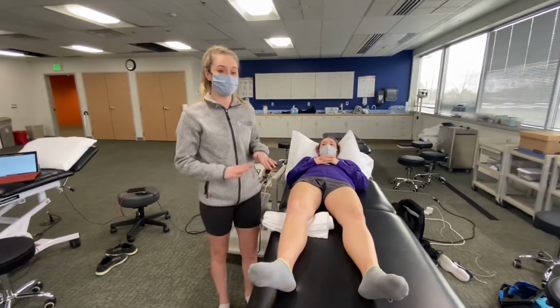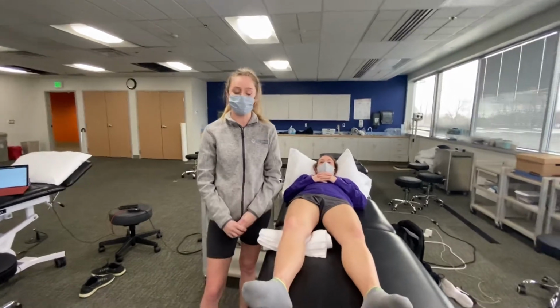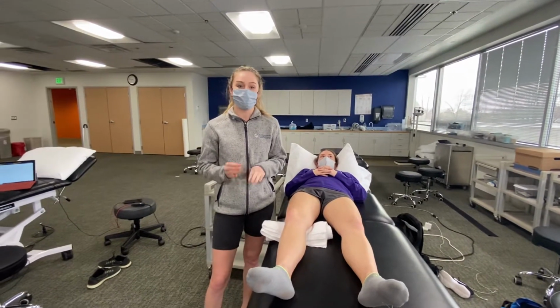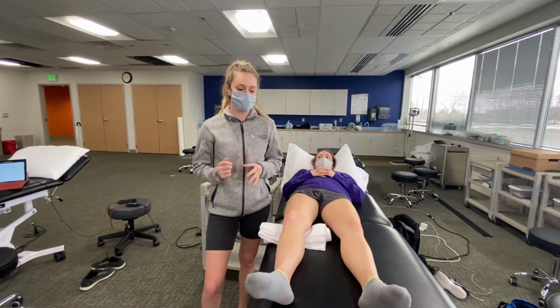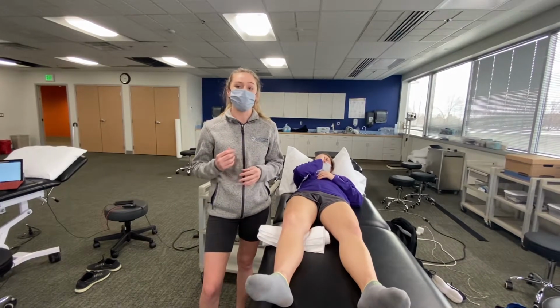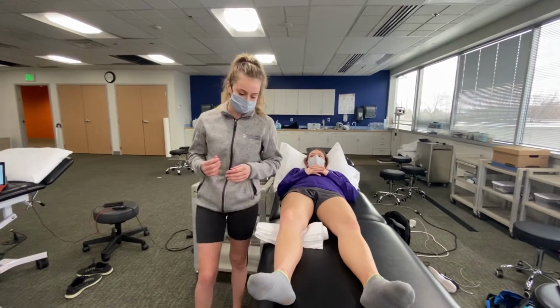Right, we're here today with my patient who has osteoarthritis in the knee with moderate pain of 5 out of 10. Today we're going to apply E-stim biphasic pulse current TENS. What this is going to do is activate the A beta nerves and prevent nociceptive response, known as the gate theory.